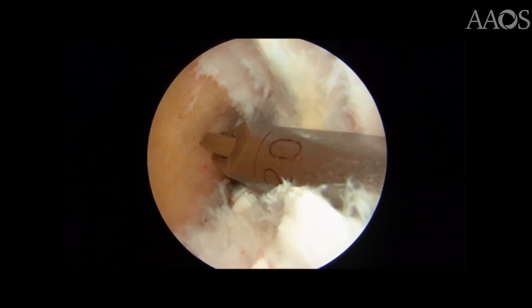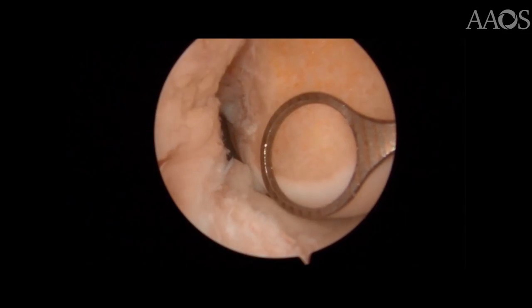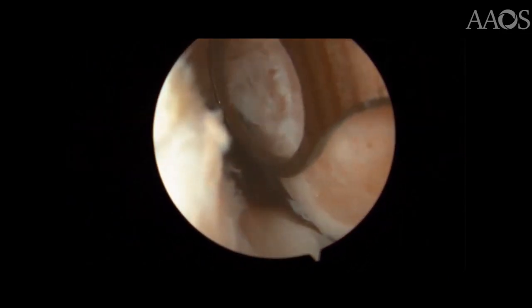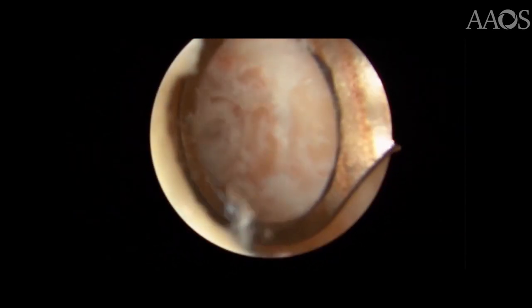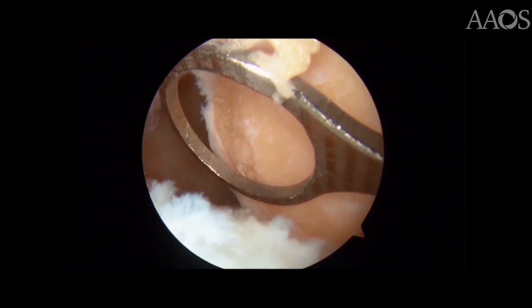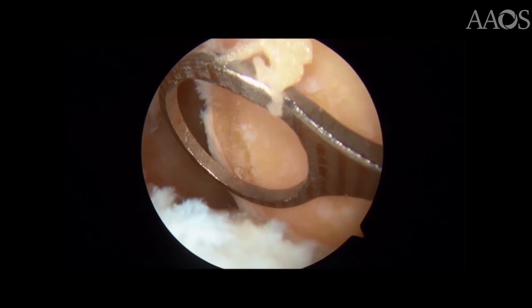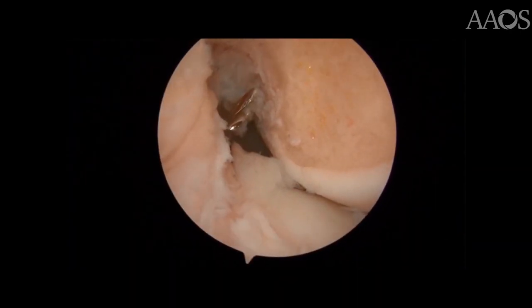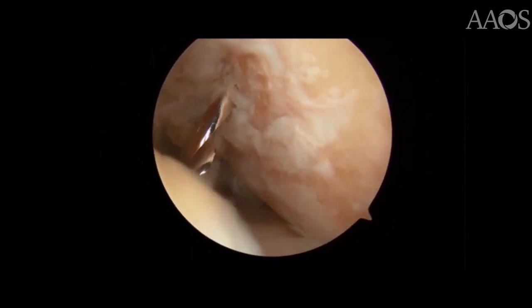Here the guide is placed directly on the back wall and a guide pin is drilled. If a small portion of the native anatomic ACL footprint is preserved after notchplasty work, a femoral guide can be placed directly over it for outside-in drilling. In this clip, a femoral guide is used for anatomic outside-in femoral tunnel drilling. Arthroscopic visualization shows good positioning of the guide pin within the native anatomic ACL femoral footprint.